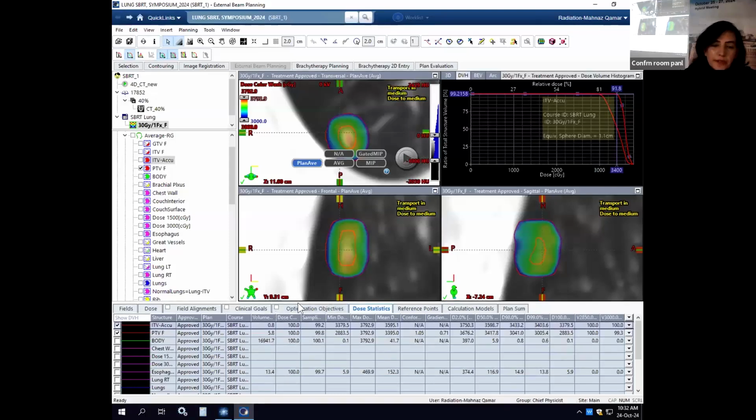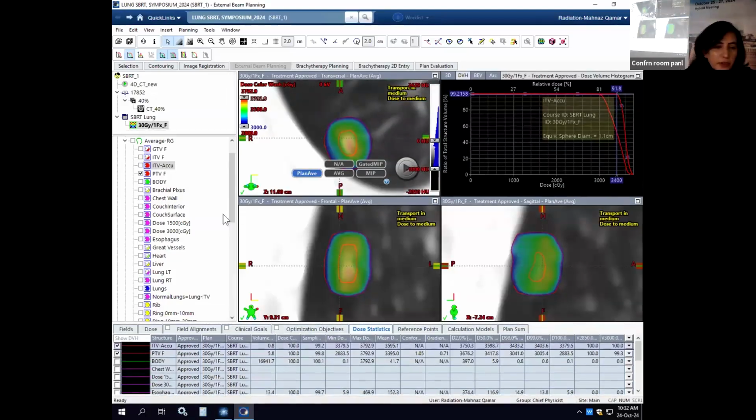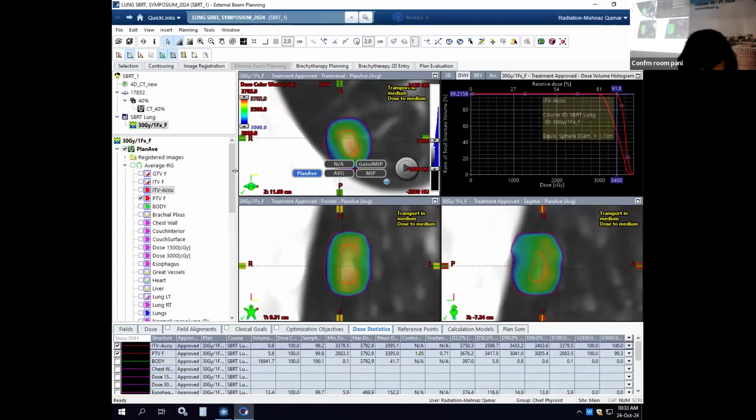Another plan objective in this case is our dose fall off or spillage. So we use that table from the RTOG lung protocol, and the fall off and the spillage is based on the volume of the PTV. In this case, the volume of our PTV is about 6 cc's. So if we look at that form that I showed earlier, at D2cm the dose should fall off up to 50% based on the volume.